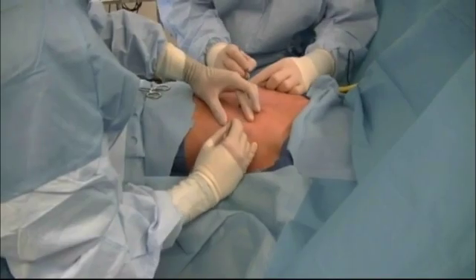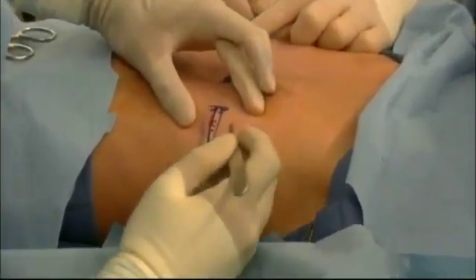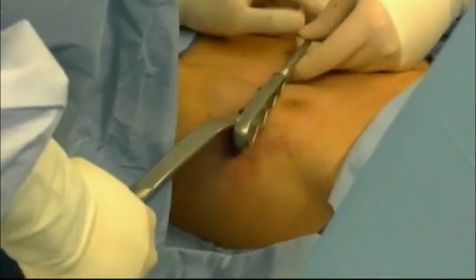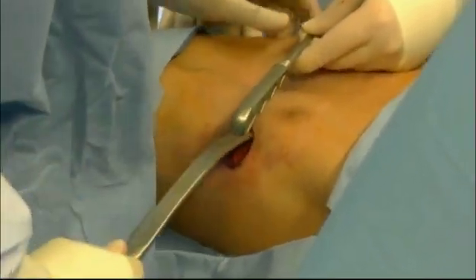We initially make incisions on the left and right sides of the chest, which are approximately four centimeters in length. Afterwards, we tunnel down onto the rib space and then pass a bar across the chest behind the breastbone and in front of the heart.